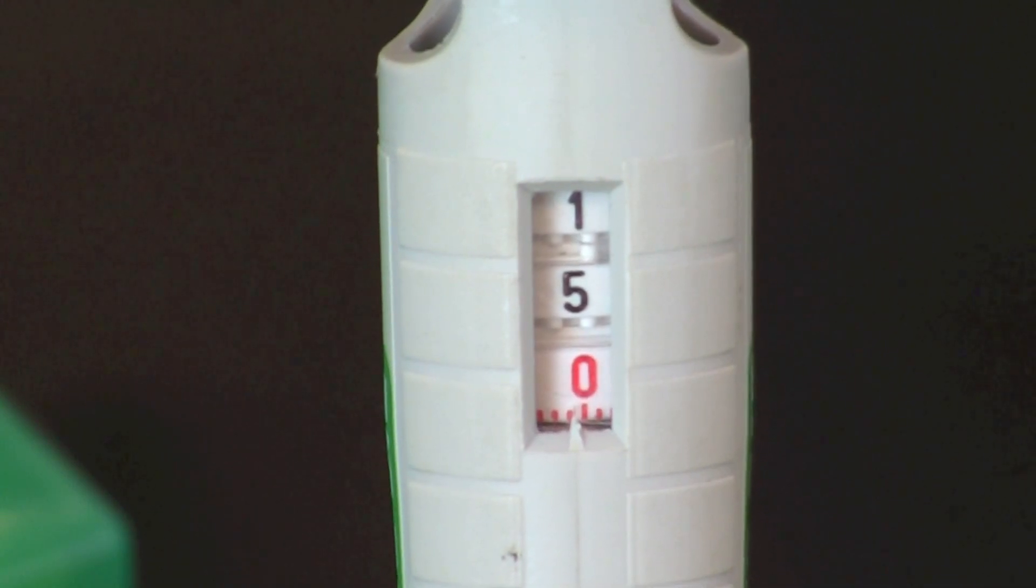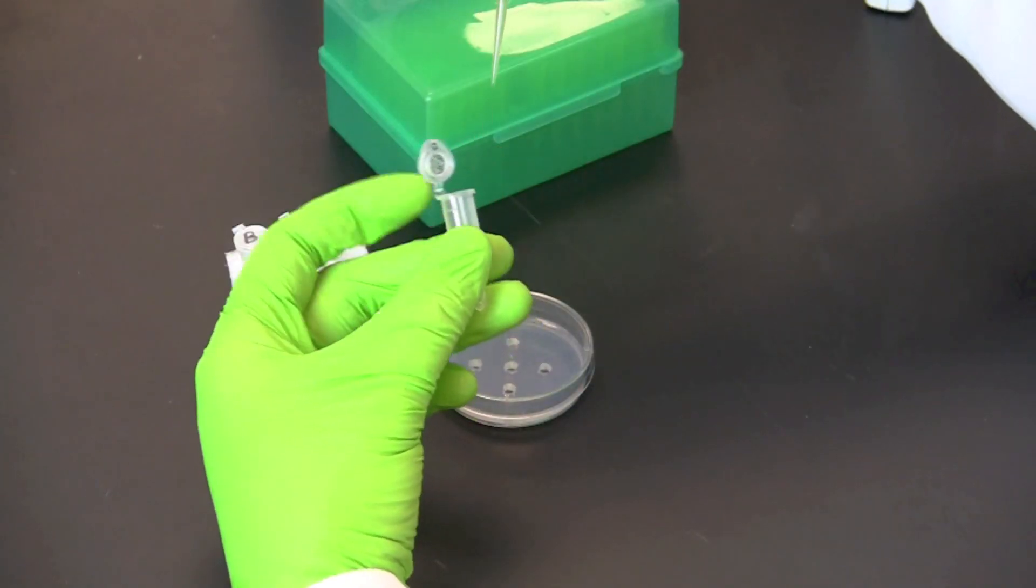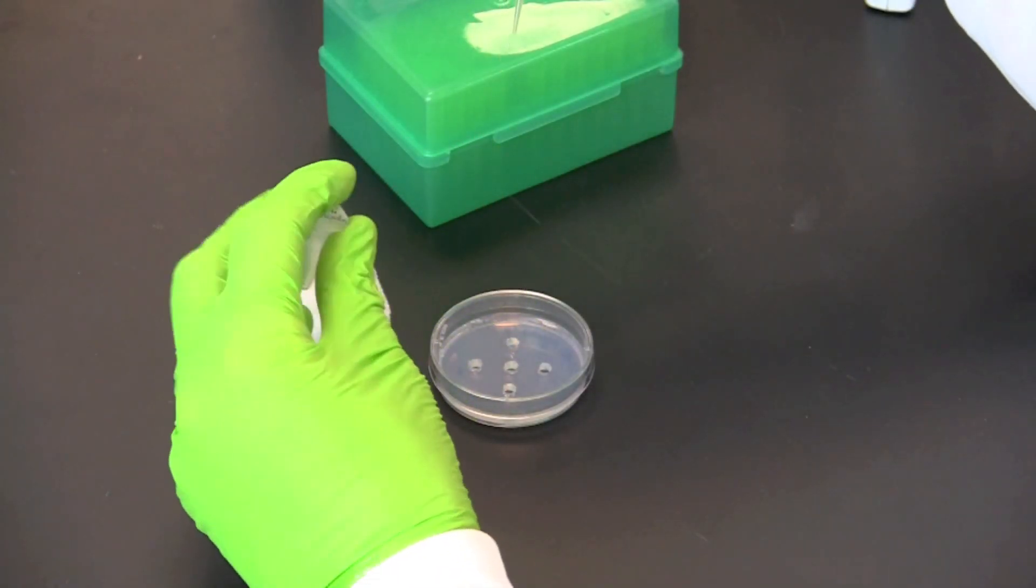Set a micropipette to 15 microliters and pipette 15 microliters of anti-chicken antibodies into the center hole.